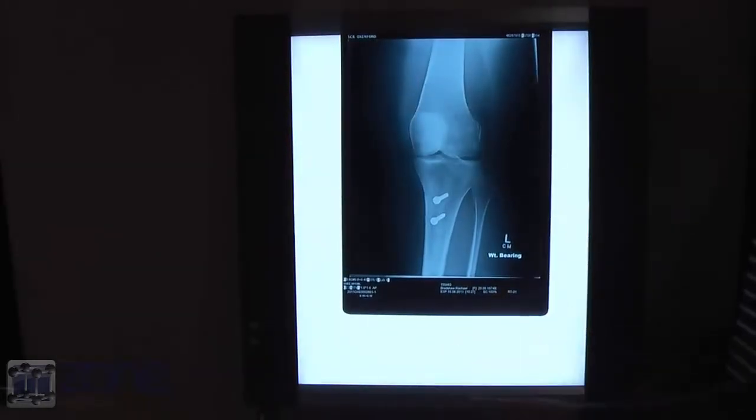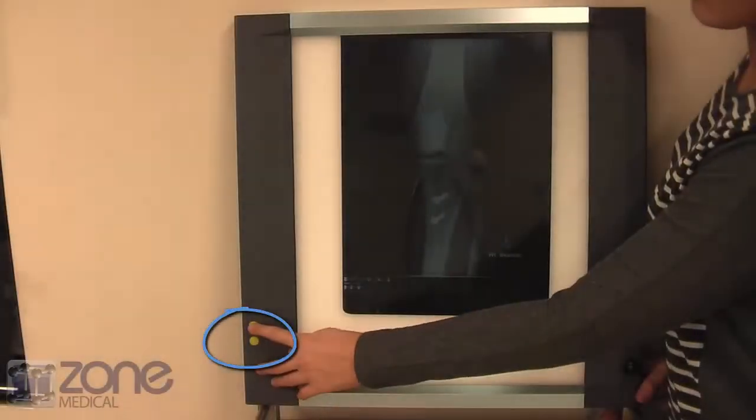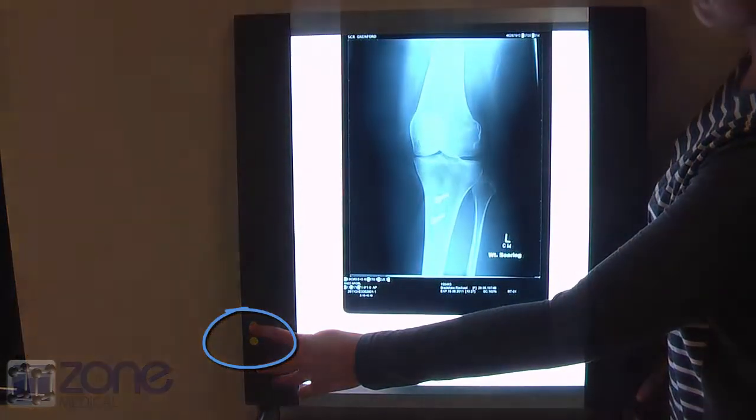To keep the viewer on, press so that the one line is down and you are able to turn on and off as needed. To adjust the brightness of the viewer, push the two yellow buttons to adjust. This can happen even when there is no film in the viewer.